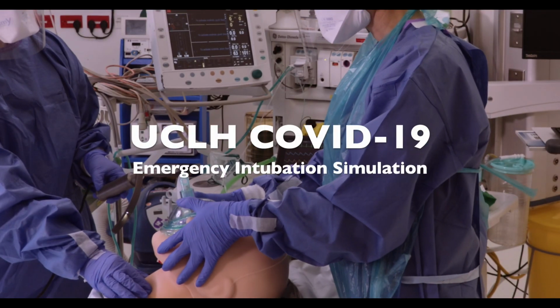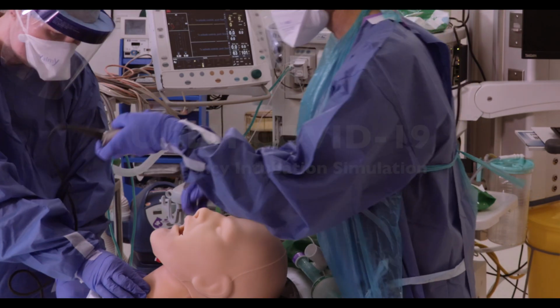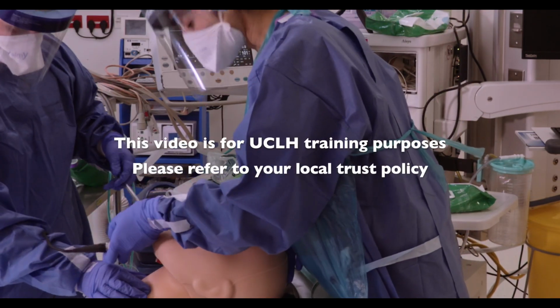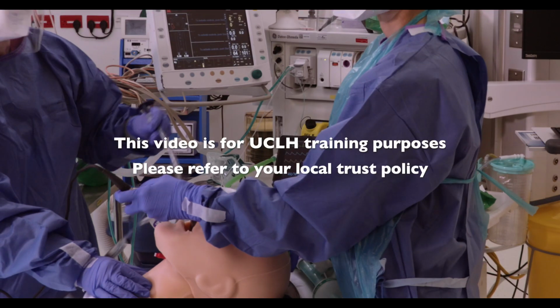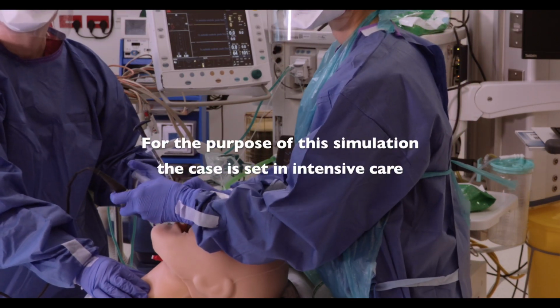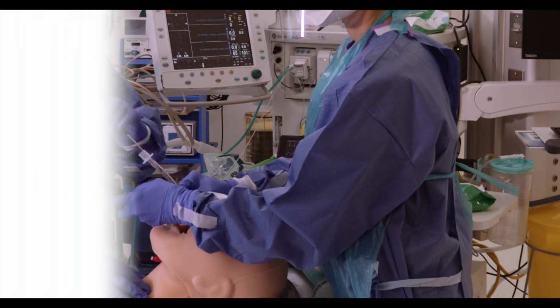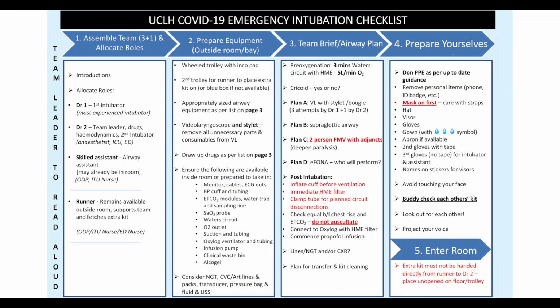This video is a simulation of our COVID-19 emergency intubation checklist. We've developed our guideline based on both national guidelines and local expertise. Please note that this checklist will be subject to change over time, so please refer to the most recent available guidelines. The guideline consists of a number of steps.